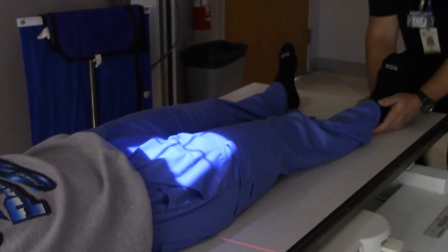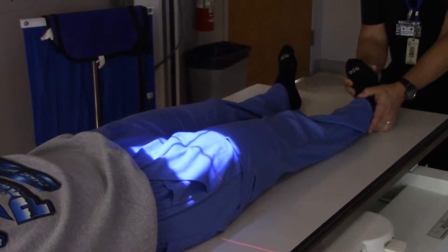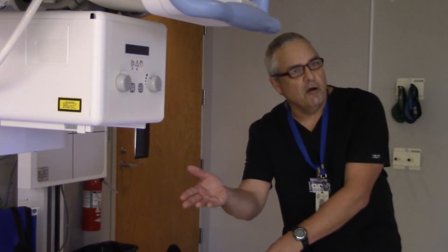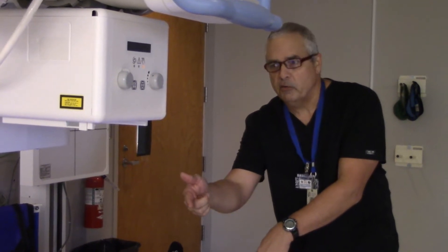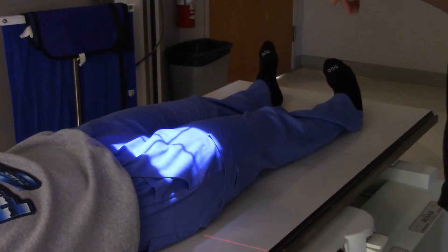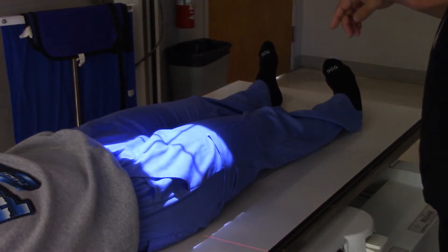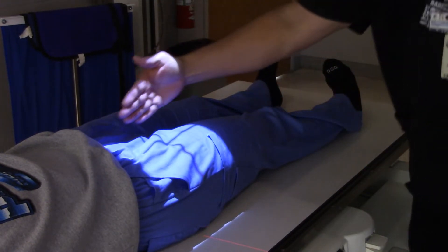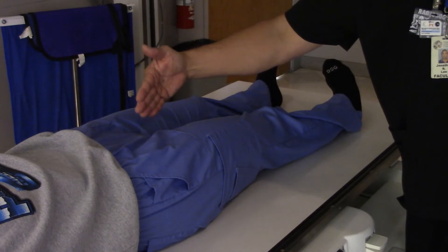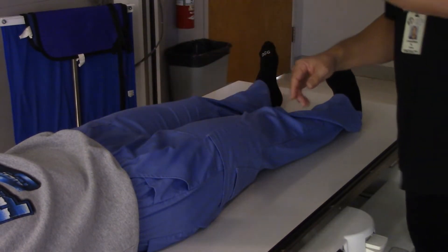I'm going to straighten out this lady's leg a little bit and also turn her foot in. Same thing as before — we just don't want any foreshortening on the neck of the femur, so turning her toe in like this is going to help a bunch. I'm going to open up the film size a little bit more. If the edge of your light field medially is about on the mid-sagittal plane, then that's perfect.